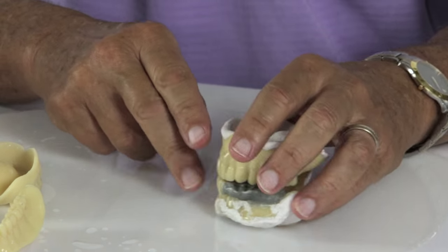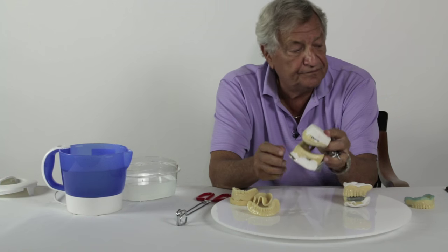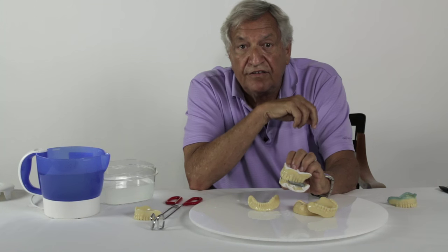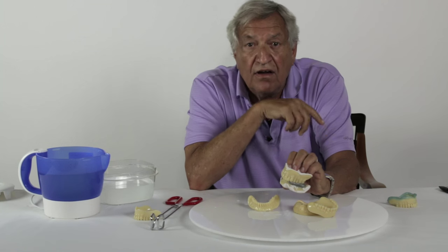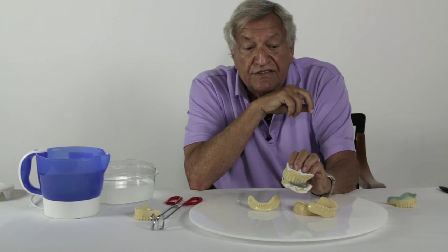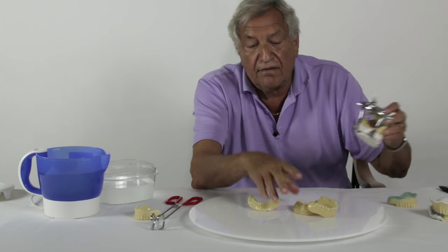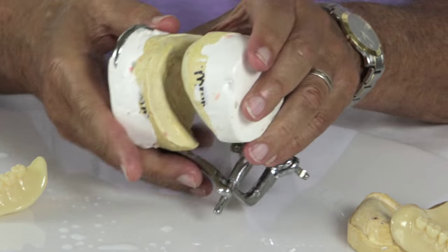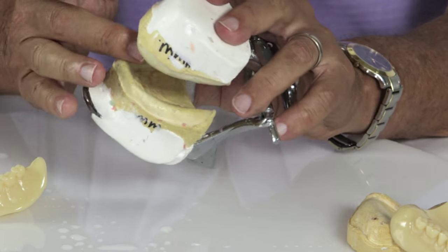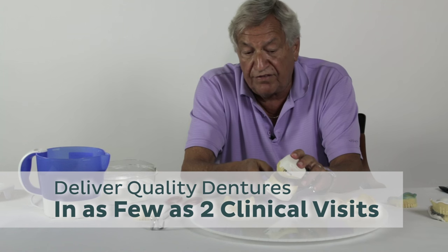If there are any questions, the laboratory can send you back a wax try-in. And this is what goes to the laboratory — all in one clinical visit. All the information and all the final impressions have been done, and he has everything the laboratory needs. They pour two models, articulate them, and then work from this system, and they can do any conventional type of denture that the laboratory wants to fabricate.